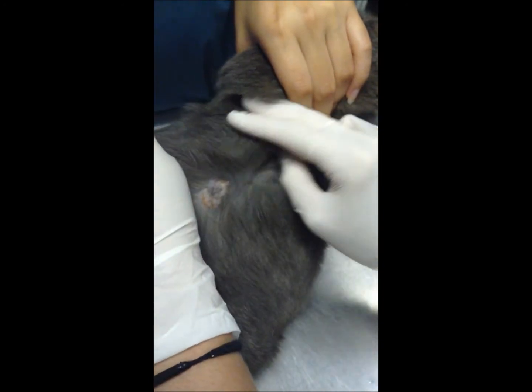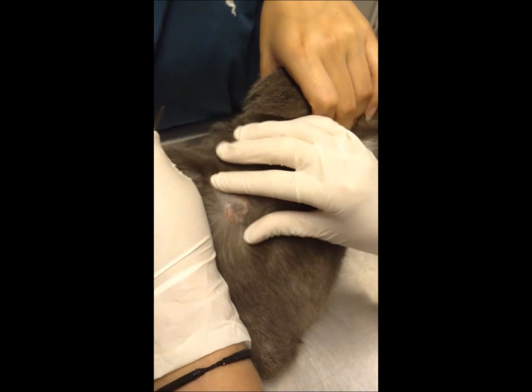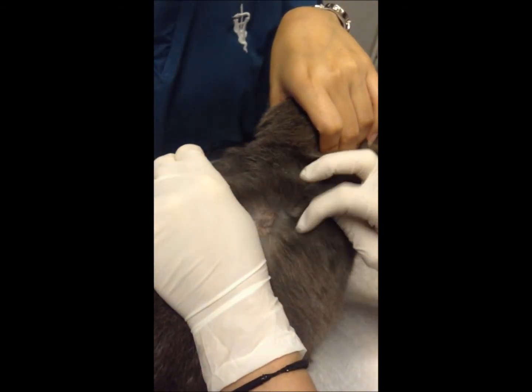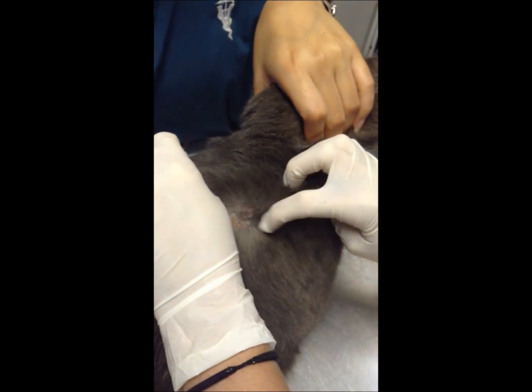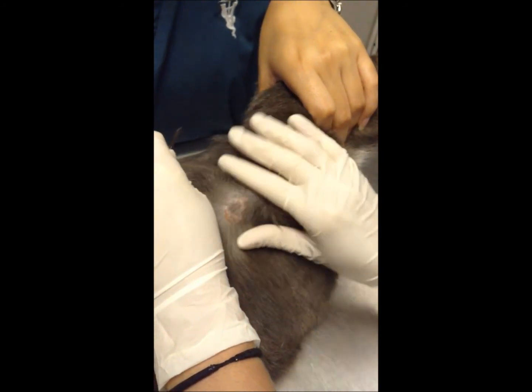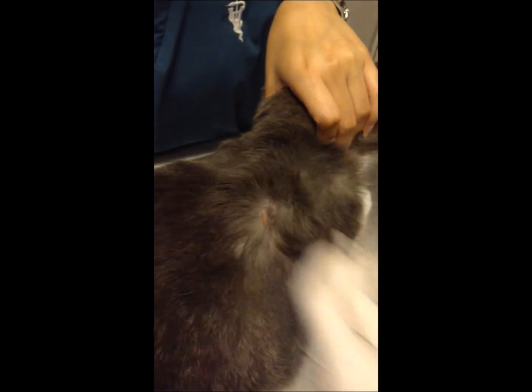We're going to do a skin scrape on Barney. He has a whole bunch of skin lesions going on, and we're not totally sure what they are. Normally, we do skin scrapings on dogs to look for different types of mites, demodectic mites, sarcoptic mange, stuff like that. But we're going to do one on Barney because we have him here.